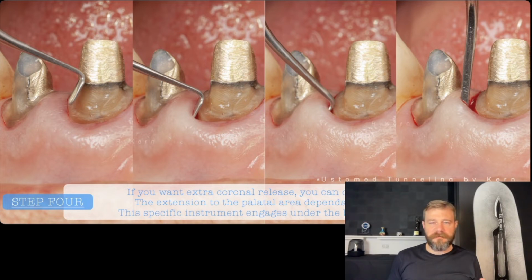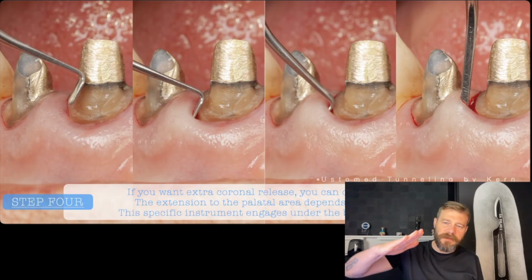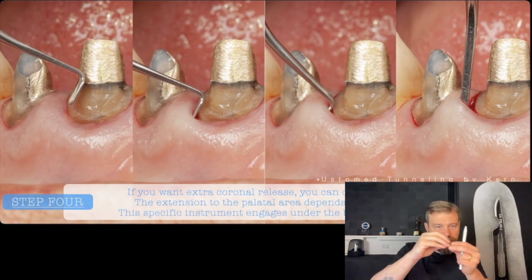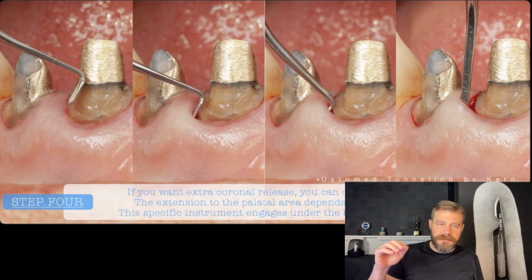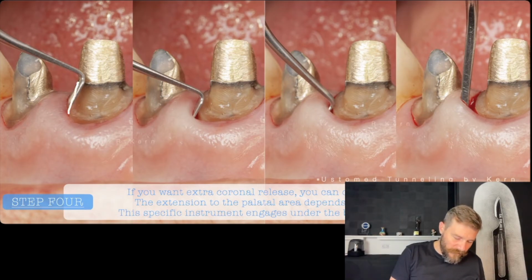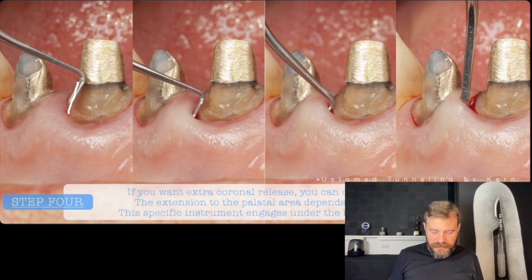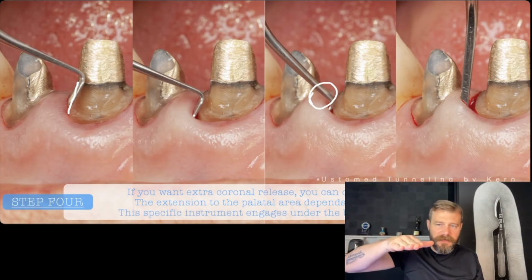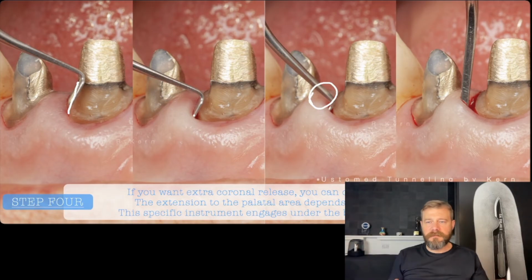How to do that? So we developed another instrument that we call the rabbit foot. Why is that? Because it has exactly the same anatomy as the foot of a rabbit. So this instrument is going to go inside the sulcular area. Okay, now the idea is to detach this tissue on the top. You can do that just when the papillas are a little bit larger. You cannot do that in very tiny papillas. So you go inside the sulcus and you rotate this instrument to make it active under the interproximal side, so you can really lift the papilla in the center.